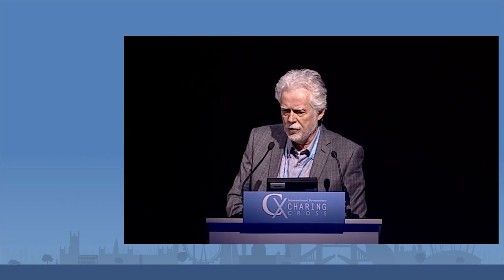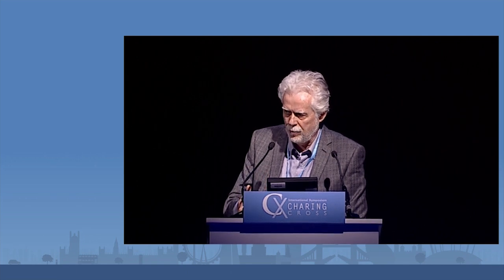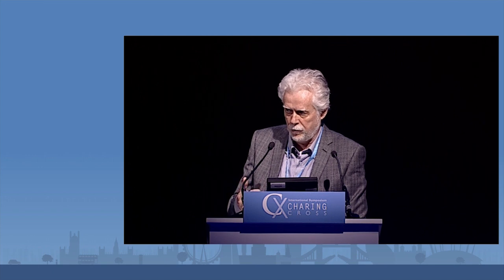There are a couple of things here. First of all, if you give this tolazoline, it will work for about 2 hours. So that will give you a little bit of a problem here. But you can use it afterwards, so that's not a problem. The way to look at it on the table is very easy. The software, by the way, is available from Philips. I have no idea what it costs. You have to talk to Philips about it. But it's available and it can be used.